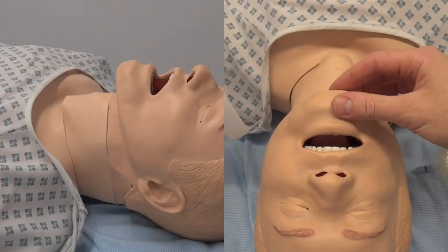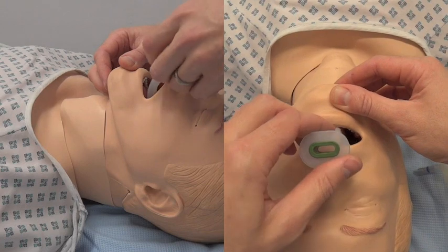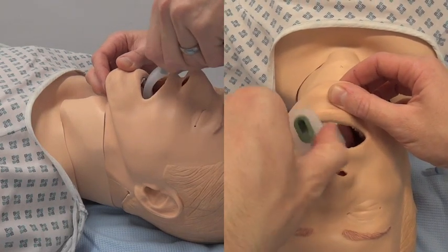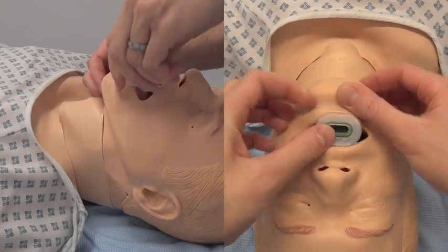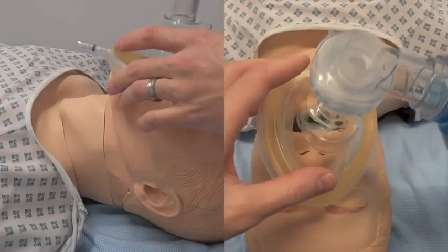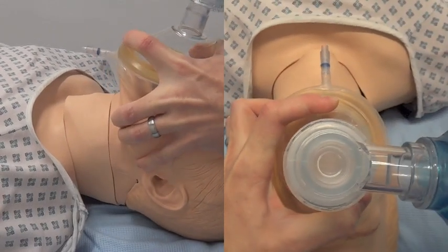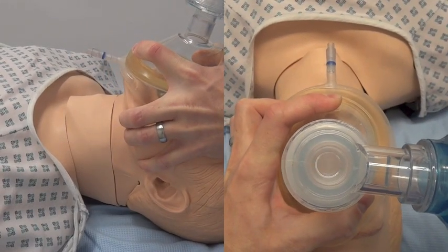If this fails, try inserting an oropharyngeal airway if the patient will tolerate it. If you are still struggling to get a good rise and fall of the chest, use two hands to hold the mask as this will often give a better seal, and ask a colleague to squeeze the bag for you.